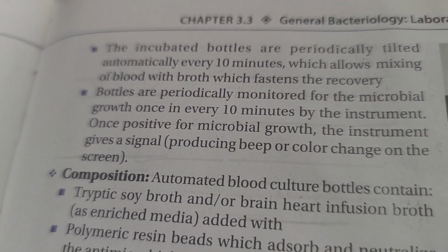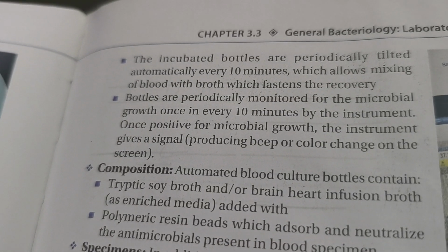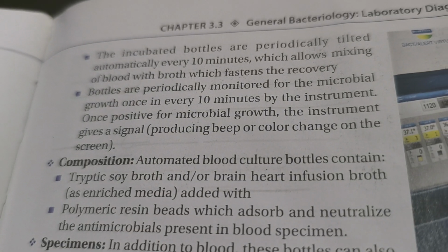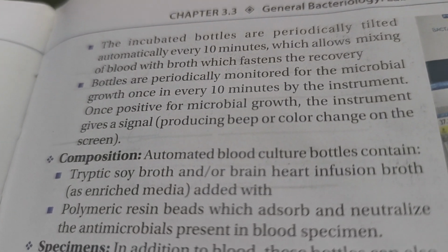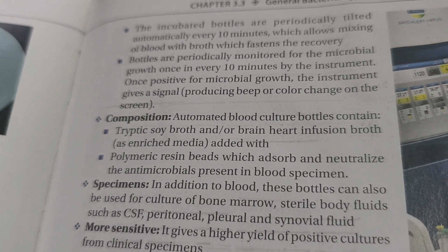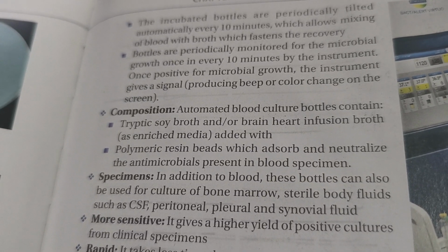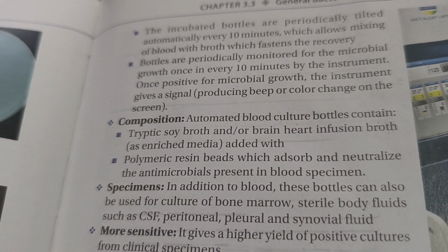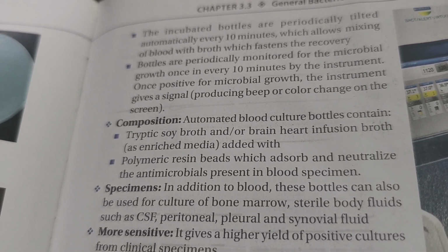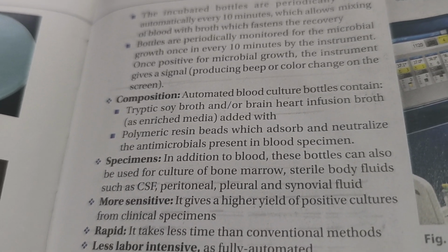The incubated bottles are periodically tilted automatically every 10 minutes, which allow the mixing of blood with broth, which fastens the recovery. Bottles are periodically monitored for the microbial growth once in every 10 minutes by the instrument. Once positive for microbial growth, instrument gives signal producing beep or color change on the screen.